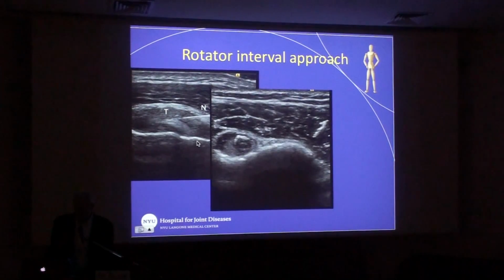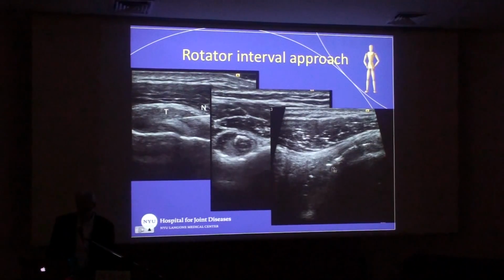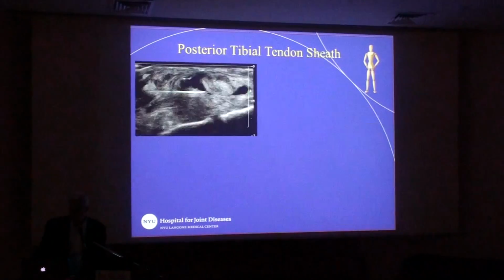You can check to see in the bicipital groove that you have distension of the tendon sheath. In fact, if you see the contrast effect, it helps confirm that the injectate went where you wanted it to go. And oftentimes you'll have distribution of the injected material within the rotator interval itself, which can be very good because a lot of times bicipital tendonitis or tendinosis actually originates within the rotator interval itself, particularly in patients who have early adhesive capsulitis. They have this extensive scarring that occurs right in the rotator interval.